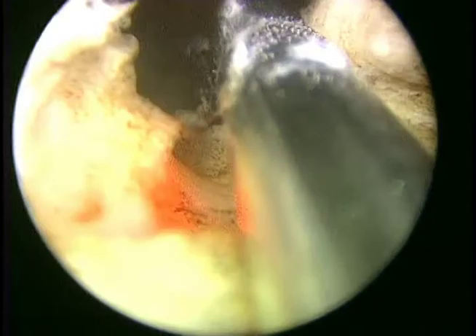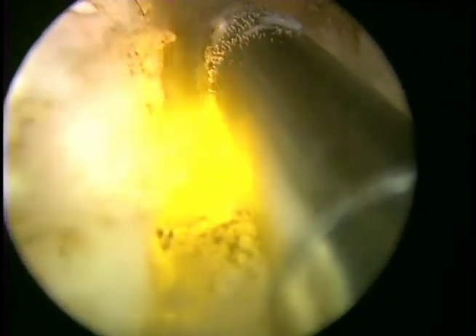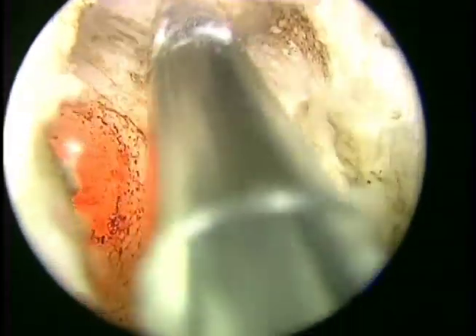Here we can see, although the channel of prostate is quite small, it is quite deep, so we're taking the necessary time to repetitiously pass over the tissue, almost sometimes using it like a knife to carve into the adenoma and get down to capsule. It is very important that we identify this landmark before proceeding on with the rest of the surgery. This will define our endpoint.